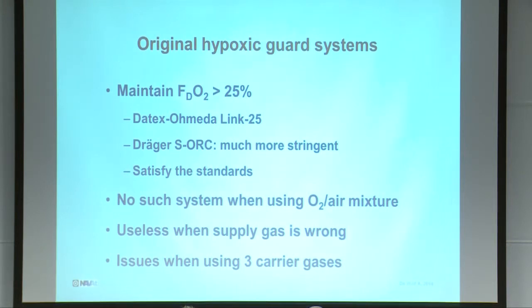However, it is remarkable that there is no such system that was developed for use with oxygen-air mixtures. It's useless when the gas supply is wrong, when the supply gas is the wrong gas. And it becomes an issue when you use 3 gases instead of just 2. It also becomes an issue when you use higher concentrations of gases, such as xenon.